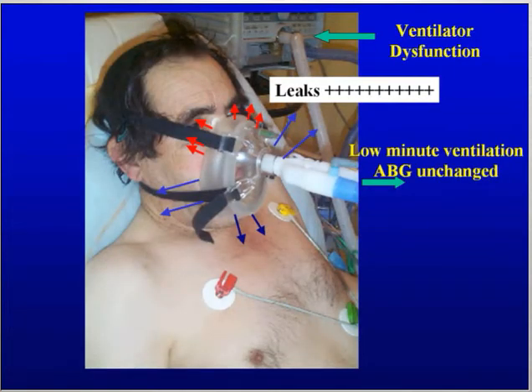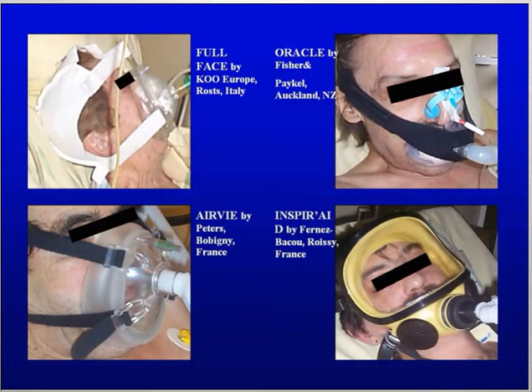The leaks and the asynchrony generated by these leaks on the ventilator are again a key issue for the success. Last year, a study performed by François Lelouch from our group was presented at this meeting, comparing, for instance, the different types of interface and the results in terms of work of breathing, leaks, and asynchrony.